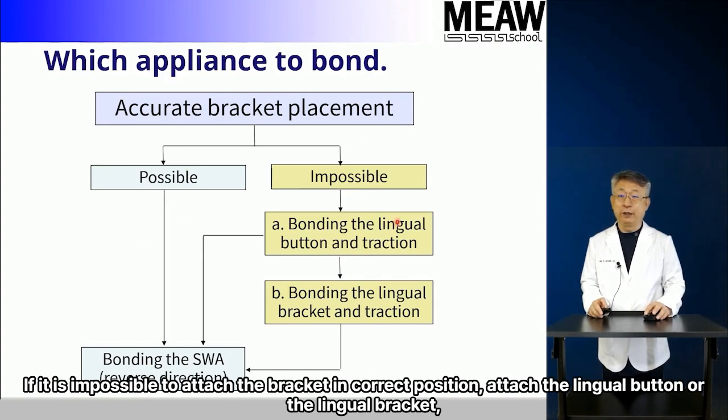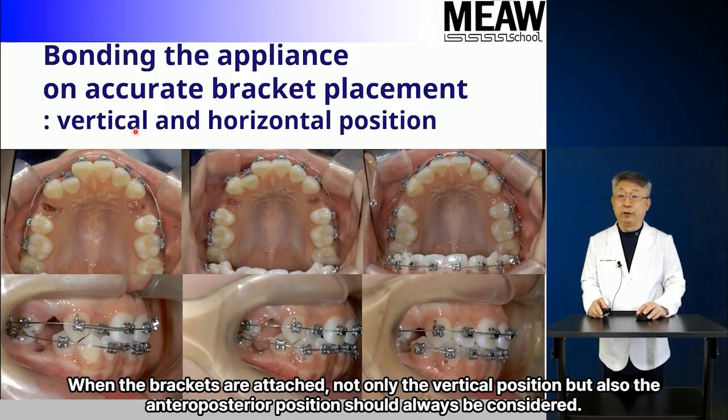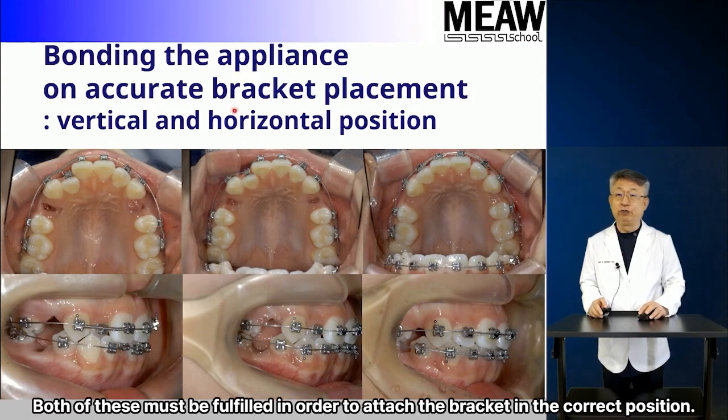If it is impossible to attach the bracket in the correct position, attach the lingual button or the lingual bracket. And after the displaced tooth is pulled into the arch, attach an SWA bracket upside down. When the brackets are attached, not only the vertical position but also the anteroposterior position should always be considered. Most of the palatally displaced teeth are mesially rotated, so the facial axis has to be located slightly mesially. Both of these must be fulfilled in order to attach the bracket in the correct position.